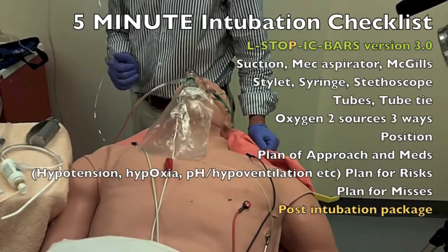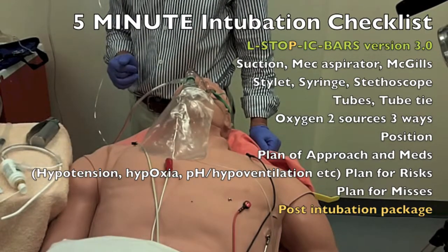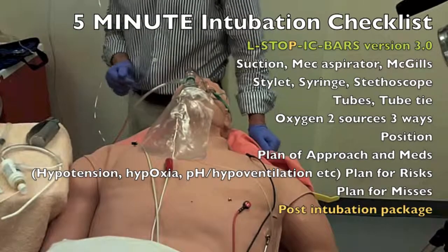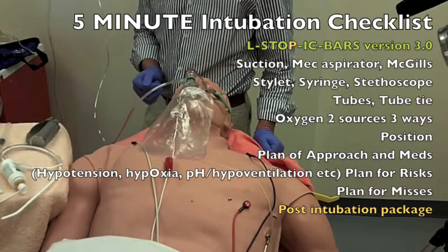Okay, post-intubation. We've got sedation and analgesia drawn up. We've got the propofol ready to go in terms of infusion. We've got fentanyl as well. We've got our tube tie ready. We've got end-tidal CO2 ready to check. We've called an x-ray to come and confirm the tube placement as well. We've got the head of the bed elevated already post-intubation.